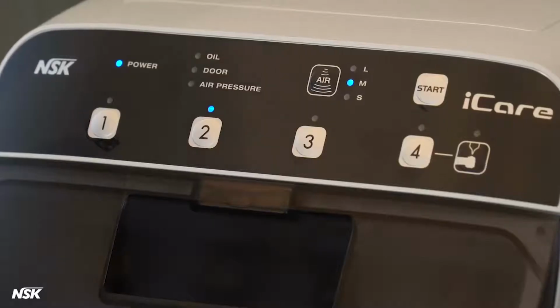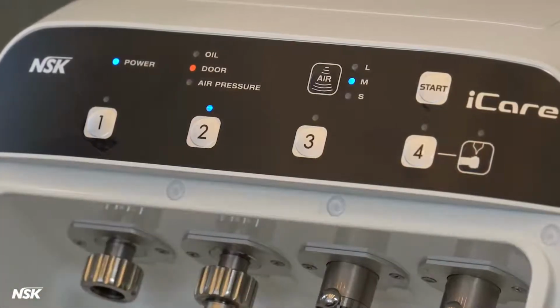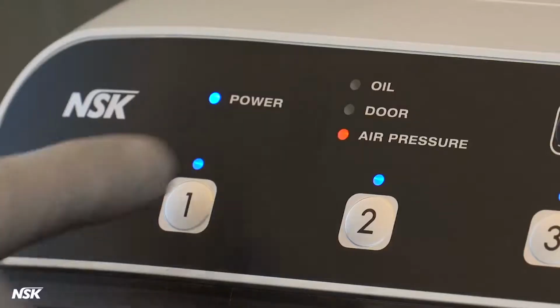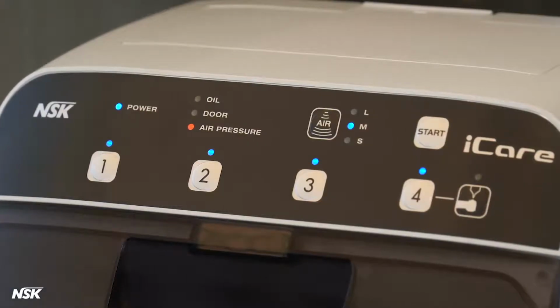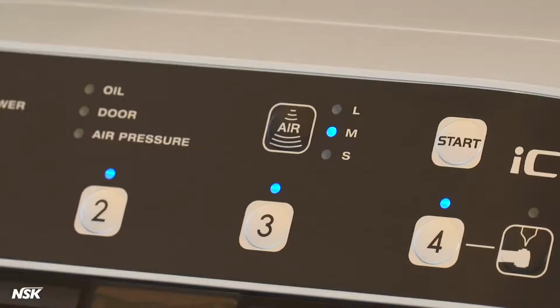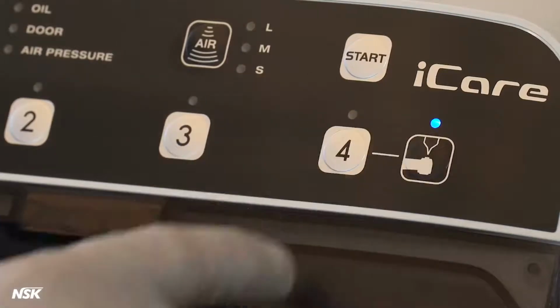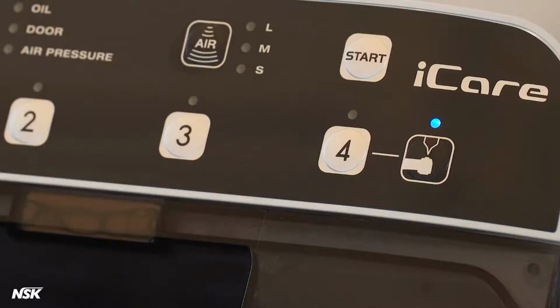Door Error LED. This means the door is open while the start button is pressed, or you open the door during the maintenance operation. Air Pressure Error LED. This means supply air pressure is too low or too high. Air LED SML indicates air mode selected, short, medium, or long cycle. Chuck Cleaning LED. This LED comes on when the chuck cleaning is selected and will blink during the process of chuck cleaning.